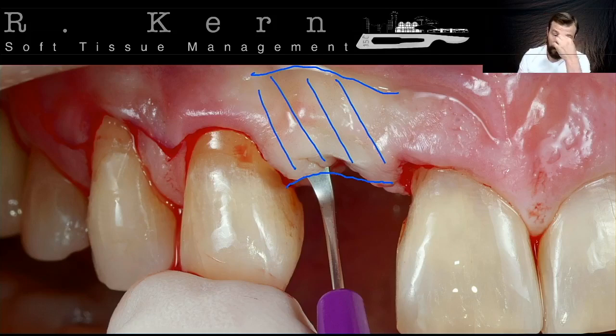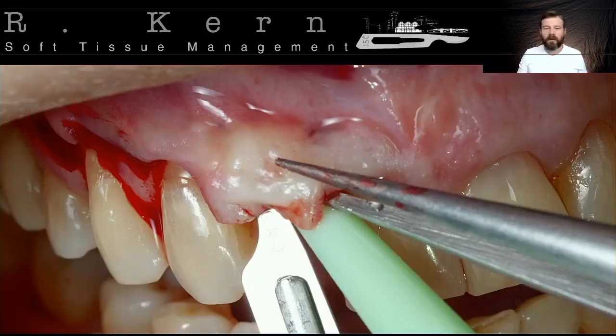That is very important. There is some anatomic information on that. The blood flows in the connective tissue, not on the surface, but in the middle of this area. If you split the keratinized tissue in the middle, the flap is going to vanish. It's going to have a necrosis on the flap, so we're really going to be low on the ground, okay? But when we reach the mucogingival line, the history is completely the opposite. We're going to bring the incision now close to the mucosa, over the muscles, under the mucosa.